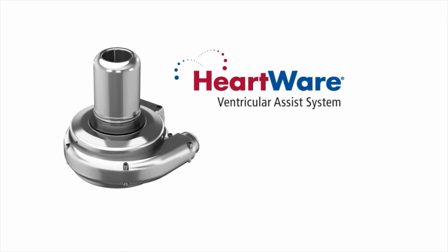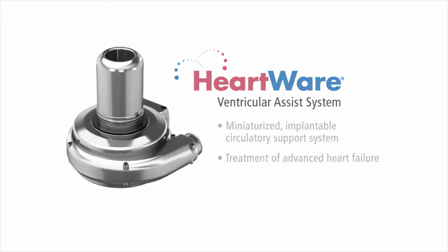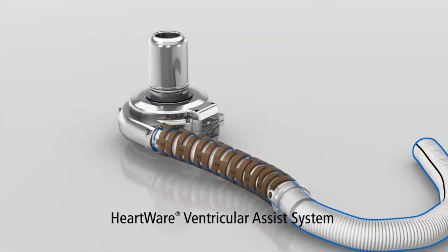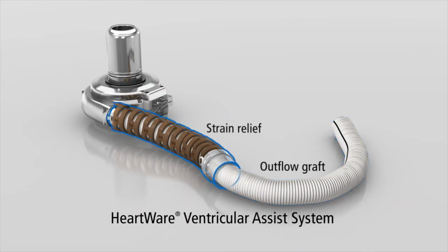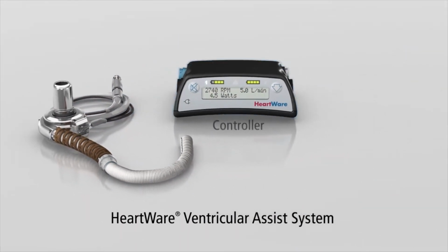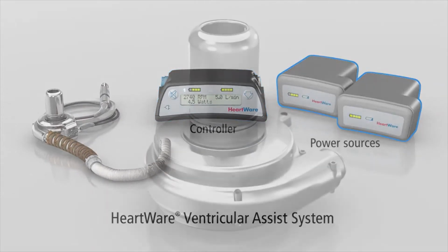The HeartWare Ventricular Assist System is a miniaturized implantable circulatory support system for the treatment of advanced heart failure. The HeartWare system consists of a small, continuous flow pump with integrated inflow cannula, an outflow graft with strain relief, a driveline, an external controller, and external power sources.